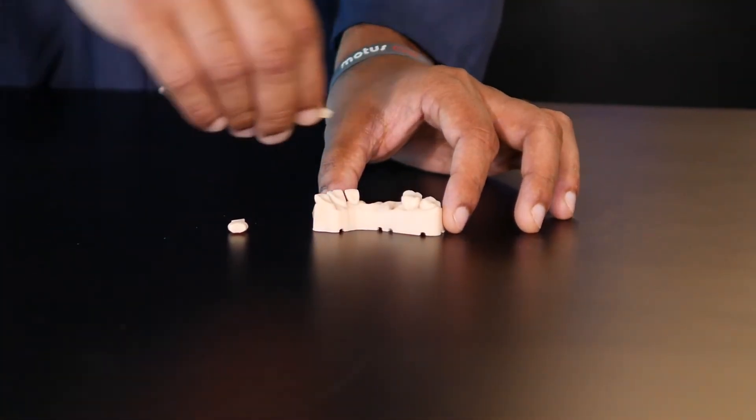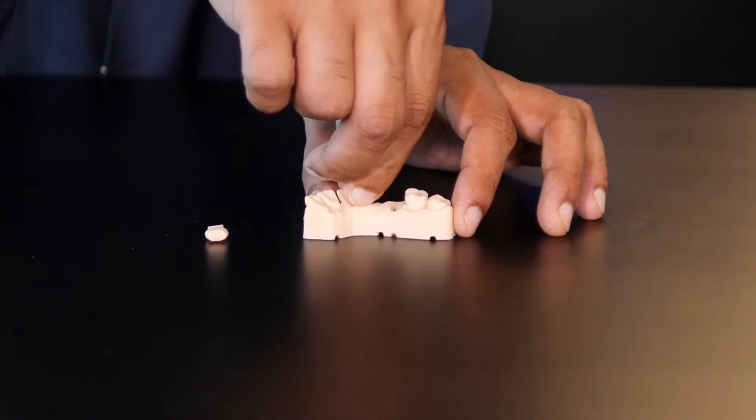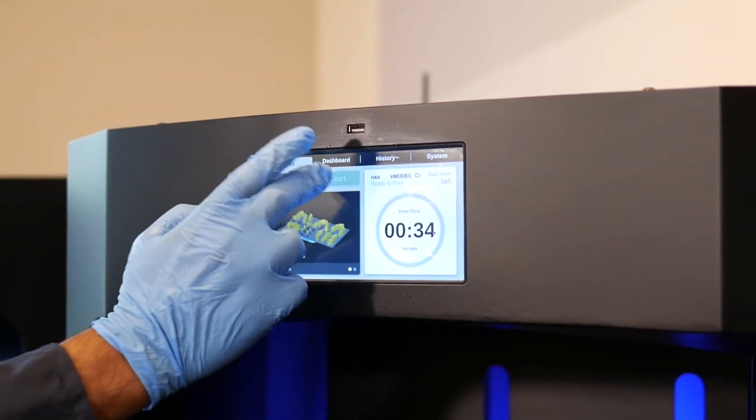Switch to high resolution mode for crown and bridge work, achieving 50 micron accuracy faster than you thought possible.